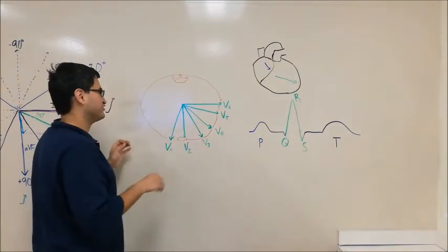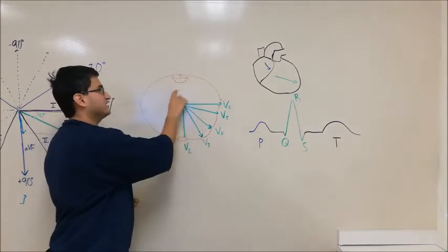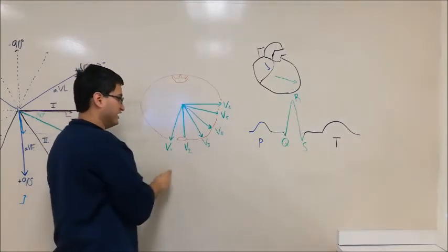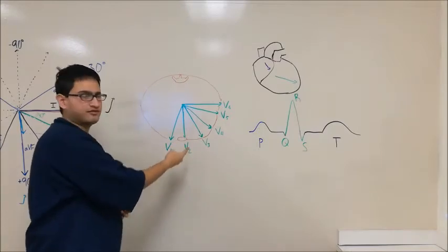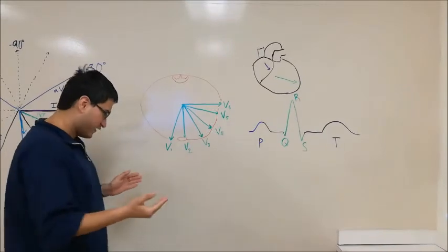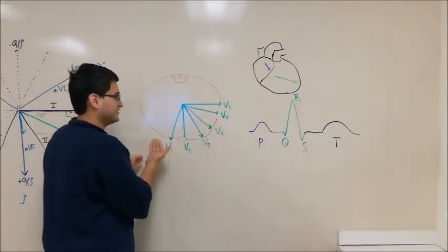This is a transverse image of a patient. This is the patient's backside, and here's the spinal cord to give you reference. Here's the patient's front or anterior side, and here's the patient's sternum to give you reference. Now, V1 through V6 represent the precordial leads. These are looking at different perspectives of the patient in this transverse plane.